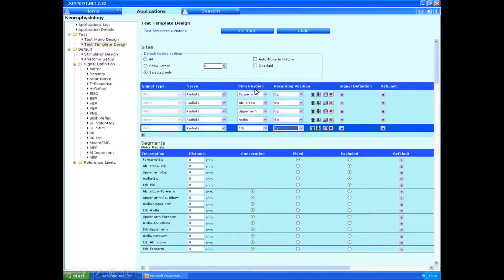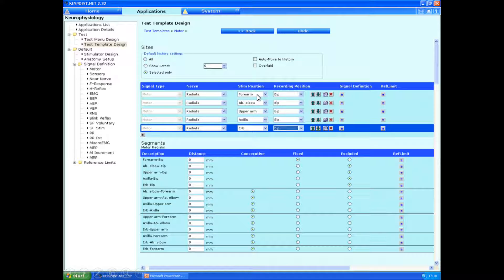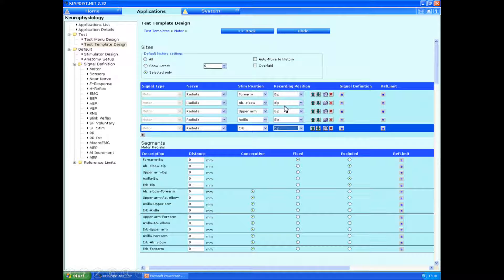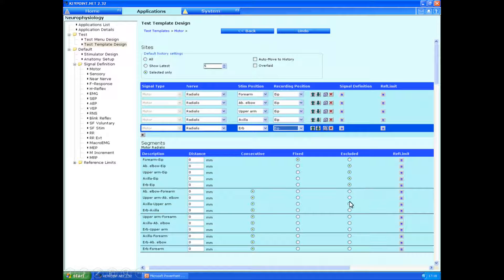Stimulating position, we can choose from the click downs. So the forearm would be the first one. Recording position, I choose to do on the EIP muscle. And then we can just keep clicking on the small little star over here to keep adding extra points where we're going to be stimulating. In the segments, you can specify set distances if you want, and you can decide how you want to have these presented by including and excluding things. But they'll all now appear on the test itself.